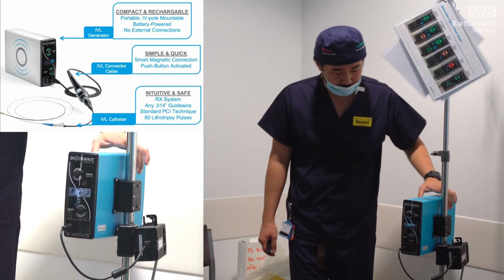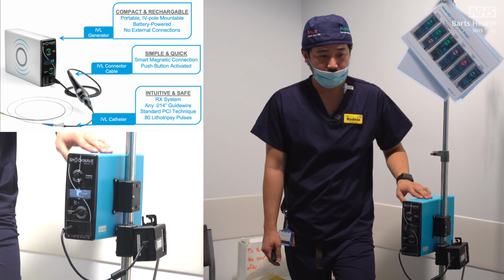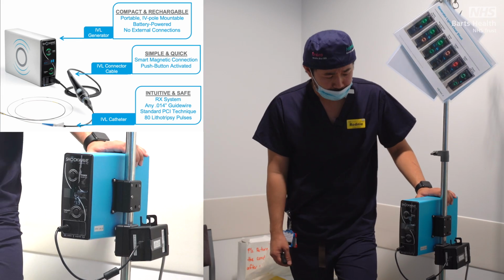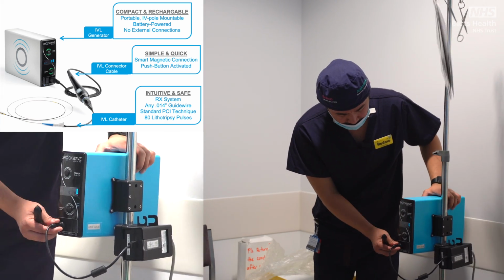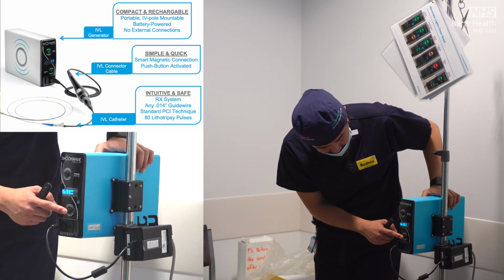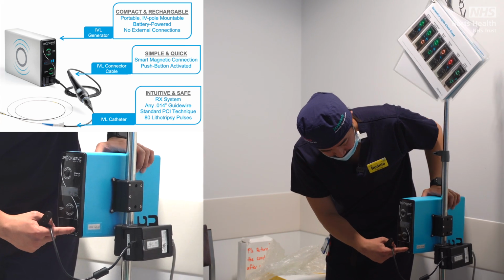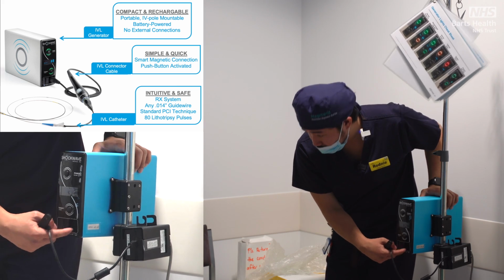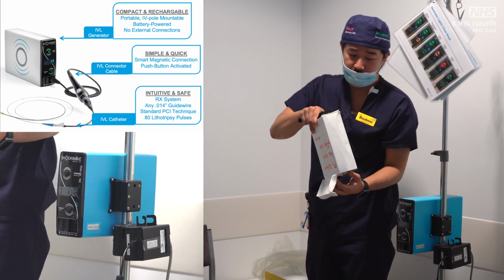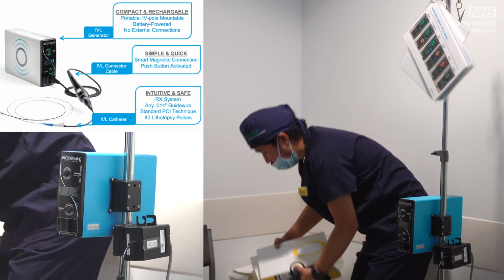So this is the Shockwave console. After every use, we should put this back on charge, so that the next day we can use it again. It has a power button. This is the therapy button, and these are the charge ports. This is a charging port, and this is the port where you connect the cable. So the cable can be found in Rob's office, and also the catheters.